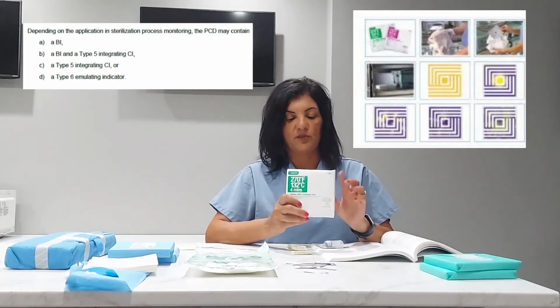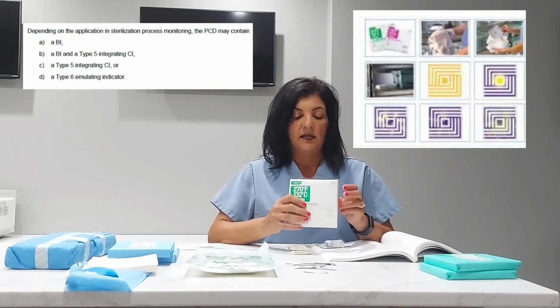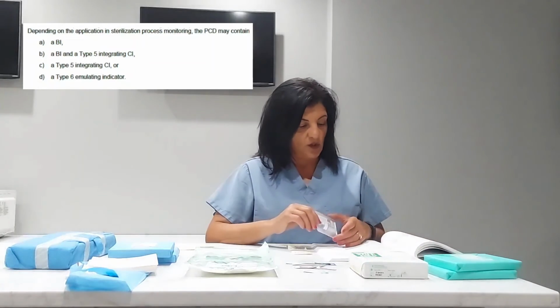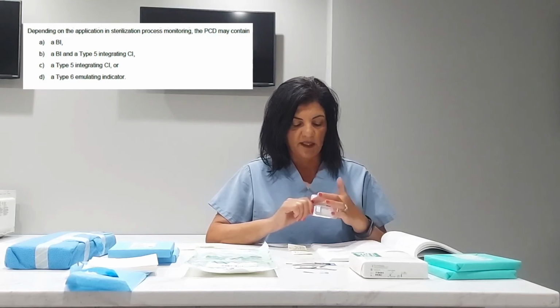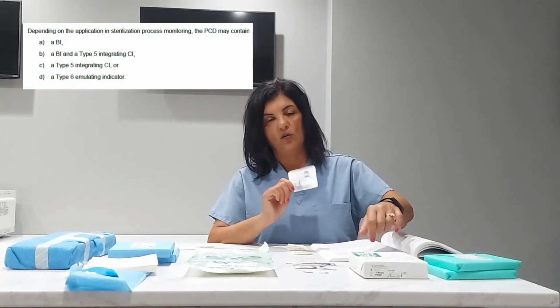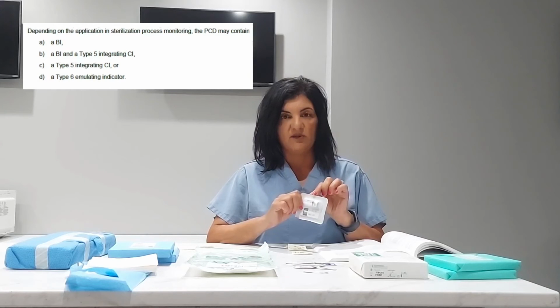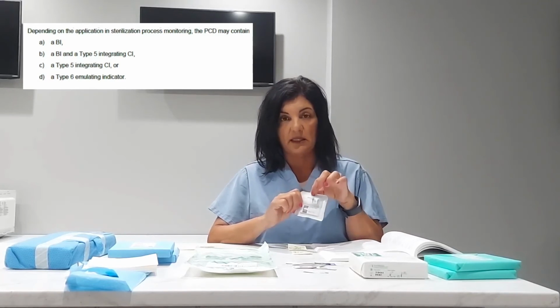Again, I'll put a picture up of what this looks like, sterile and unsterile. It kind of looks like your Bowie-Dick. It's got the cards in it and so on, and the sheet that changes from yellow to black. This particular item, this plastic, is considered the challenge. So it's more environmentally friendly without all the papers. There's a tiny little, I call it a straw, that's where the steam gets in, and this is what causes the challenge because the steam has to go in this tiny little hole.